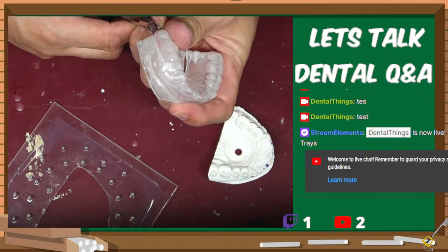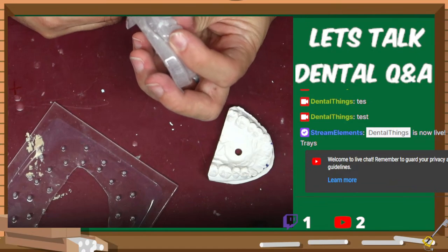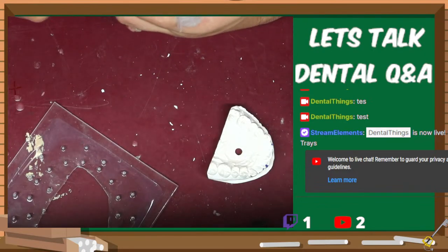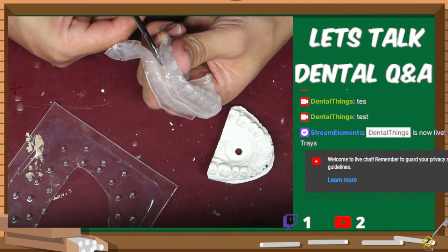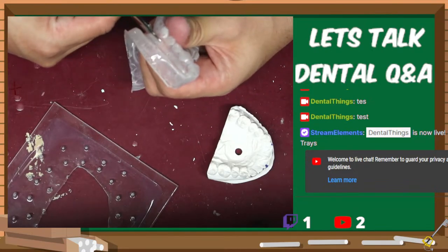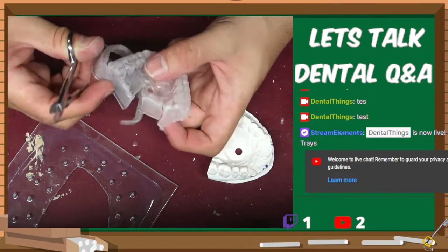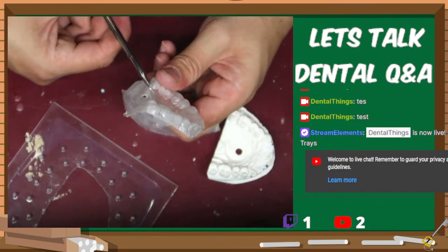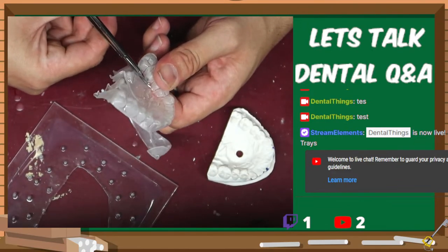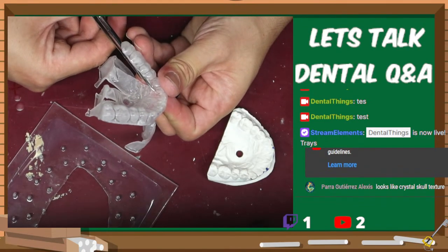And so, like I mentioned, I'm gonna start by cutting across from the tip of each tooth, so it's almost a straight line. And if I wanna cut off more later on, I can. I'll round it off on the back. Now that we're on the lingual side, the palate side, or the tongue side, I'm going to cut off just straight across from the top of every single tooth neck. Looks like a crystal skull texture. It kind of does have that a little bit.